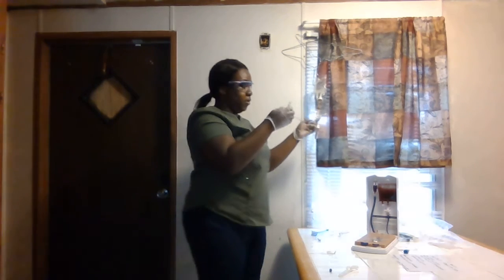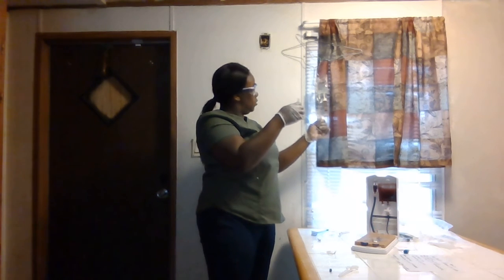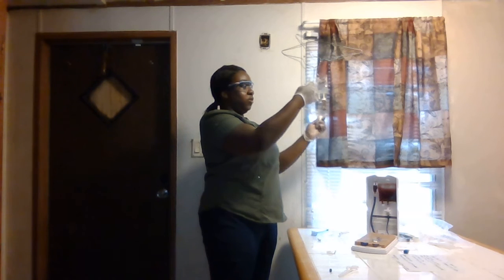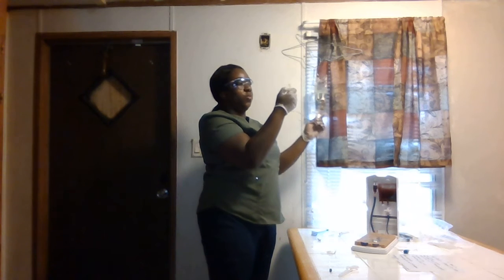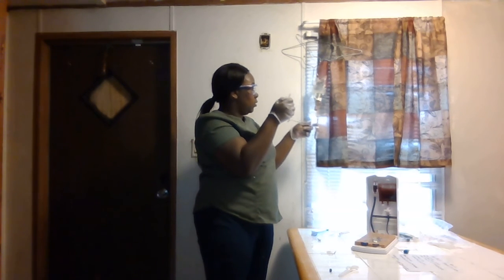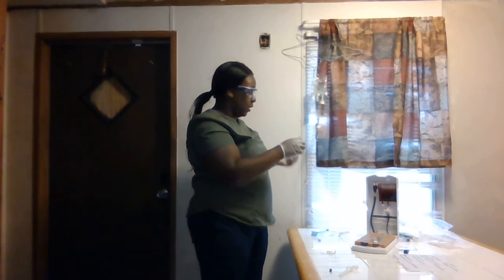Alright, and then we're ready to crank it up. Again, it's short, and again we're holding it up, watching very, very carefully. You don't want to lose control of this. Okay, and then I have it at the top. You always want to see a little bit of fluid in the cap so we know we don't have an air bubble up there. Okay, so I clamped it. Again, never lost control. Maintaining sterility. And we can attach our end cap.